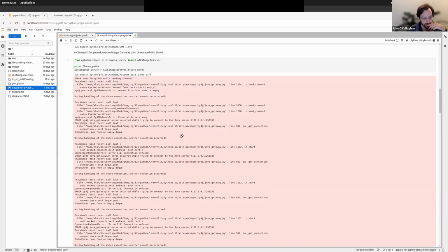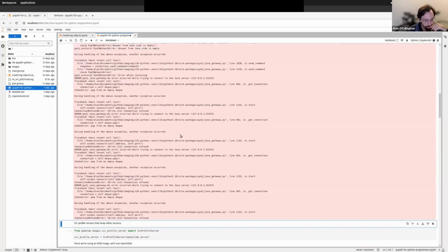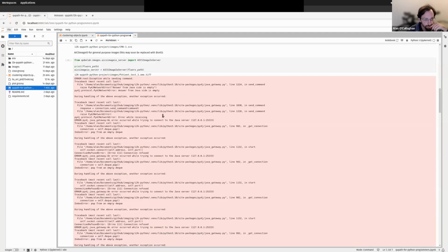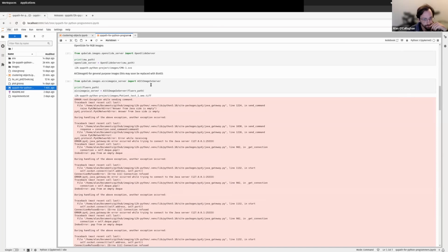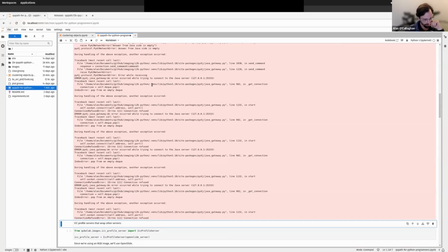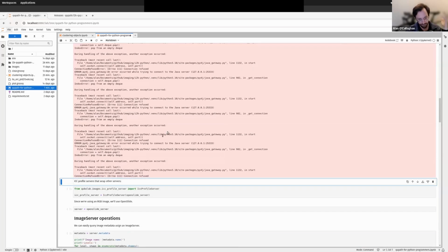Oh, good. That's a good start. Not entirely sure what's going on here. I'll visit that later on. I don't think it's important right now.